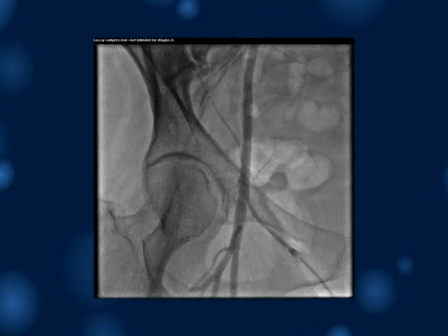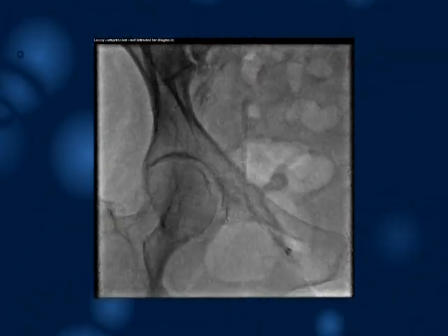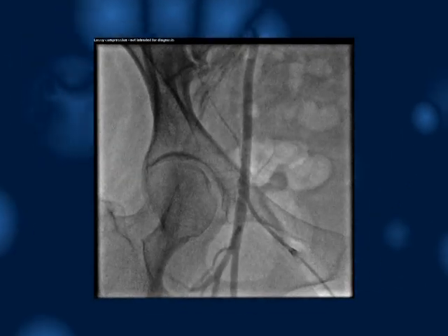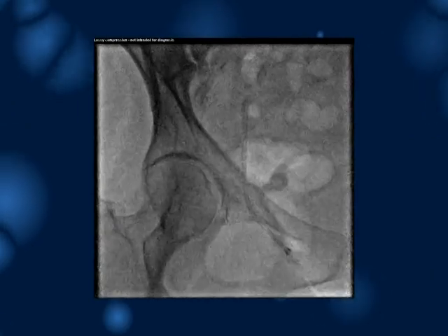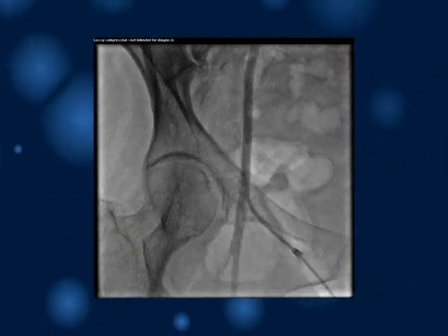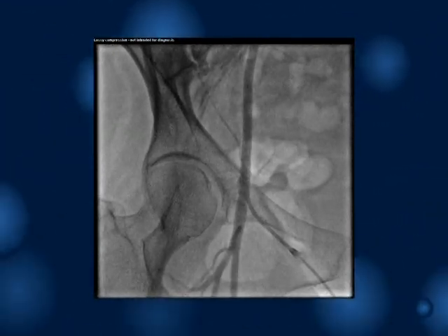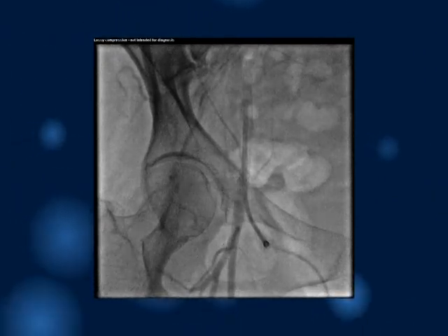Following sheath insertion, femoral angiography can be performed to identify the correct placement of the sheath. This is important either at the beginning or end of a diagnostic before proceeding to PCI, since a high puncture above the inferior epigastric artery may cause significant retroperitoneal hematoma. In this case, closure of the femoral artery may be elected, and deferment of the procedure until another time if it is easy to do so.